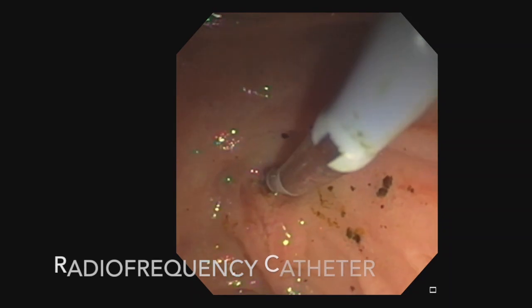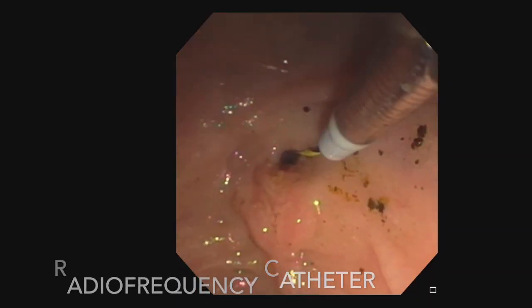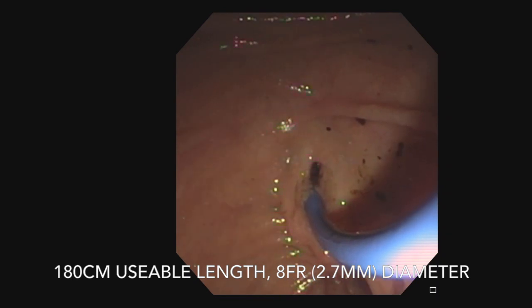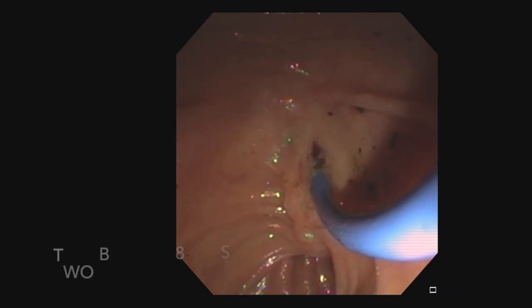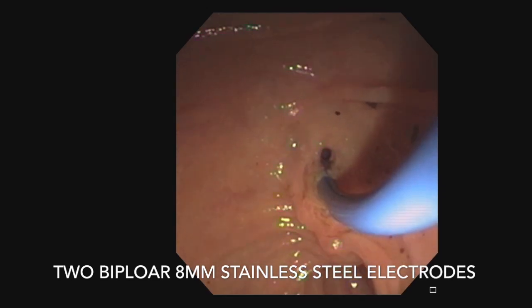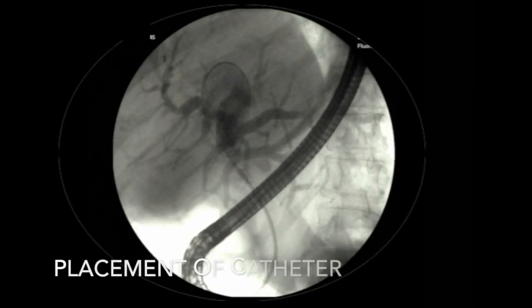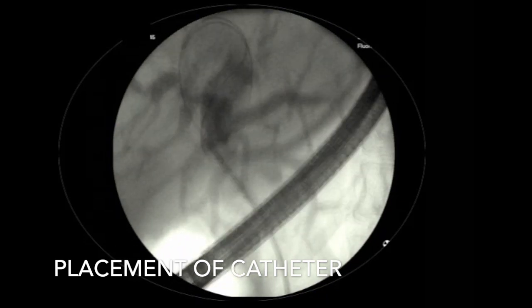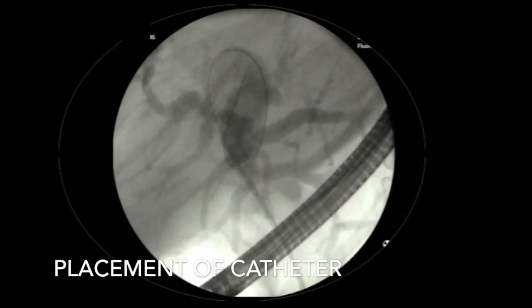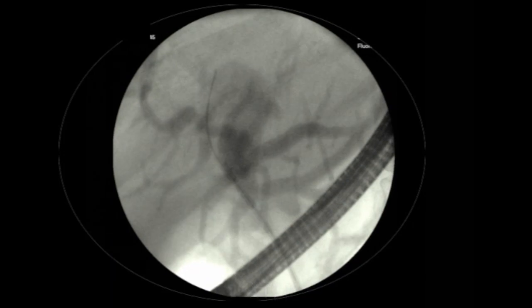Knowing where these markers are, we now place the radiofrequency ablation catheter over a guidewire left in place after SpyGlass cholangioscopy. Using just the fluoroscopic image, we place the catheter at the appropriate position — in this case correlating to the bottom rib of the patient and the top of the ERCP scope. The catheter has two 8-millimeter stainless steel electrodes separated by an 8-millimeter spacer, with an ablation zone of approximately 25 millimeters (±3 mm) in length. We position it just above the proximal extent of the tumor.